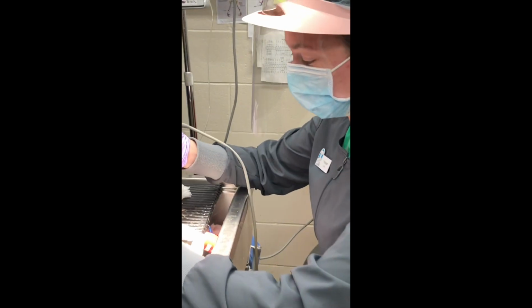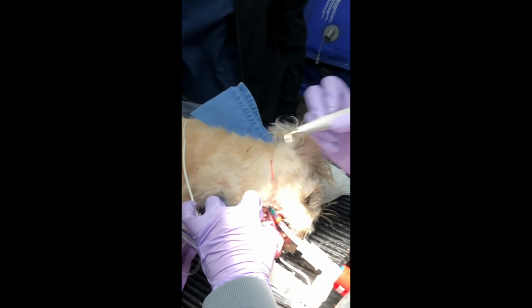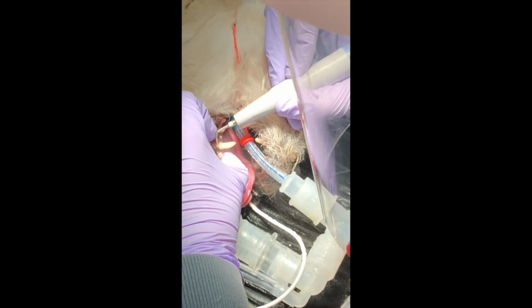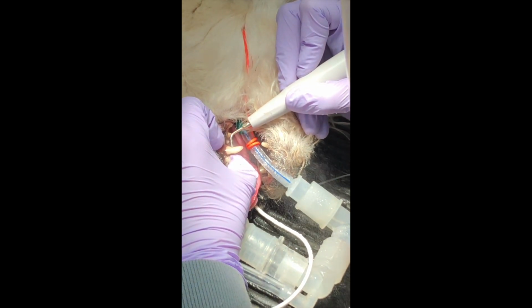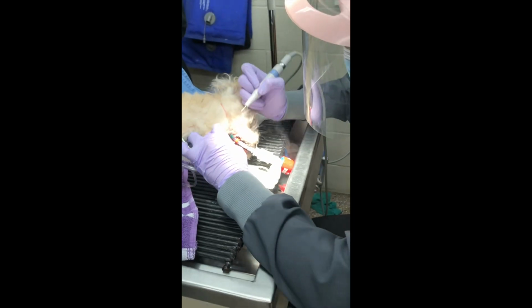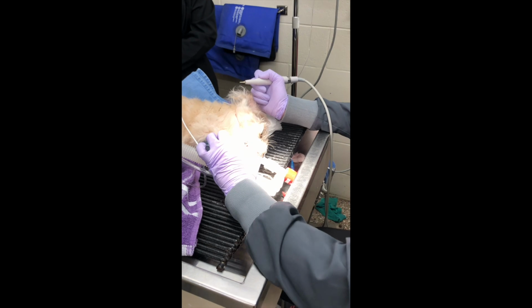Okay, I'm going to do ultrasonic scaling. You want to make sure you have a fine mist to prevent any overheating. You want to gently apply pressure with the side of the scaler, being sure to keep it moving and do not keep it on the tooth longer than 10 to 15 seconds at a time.